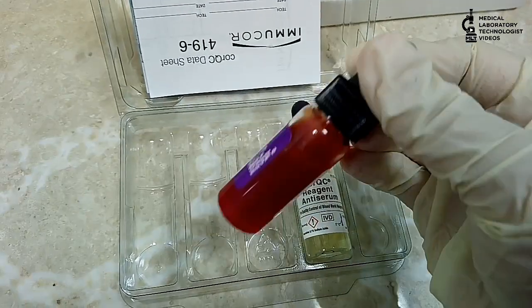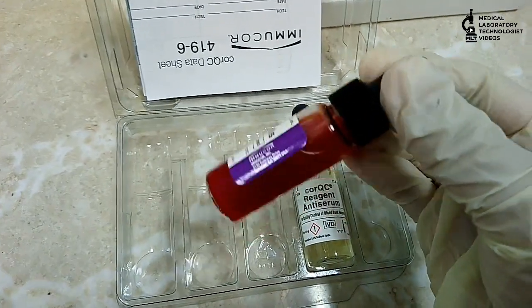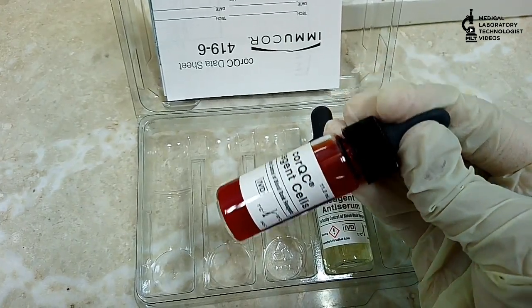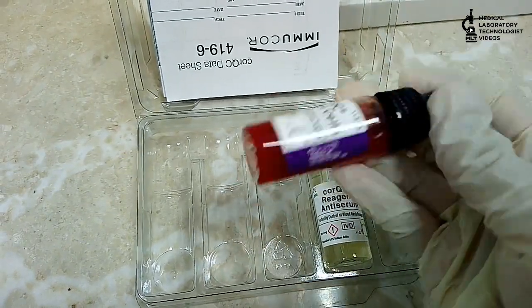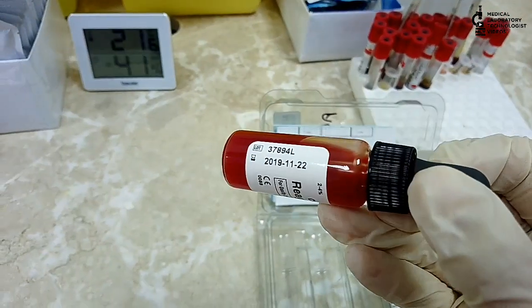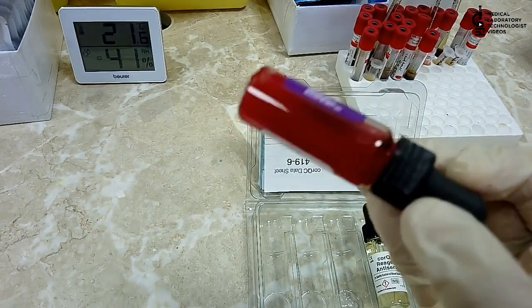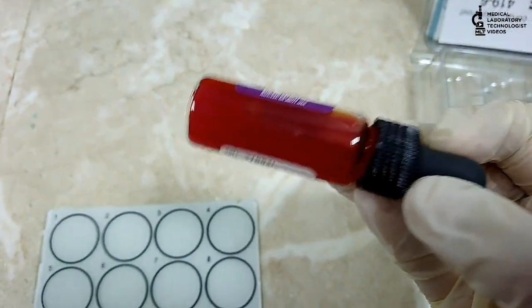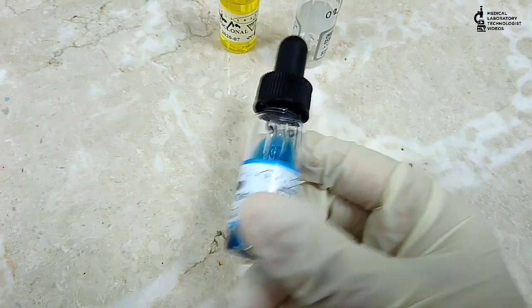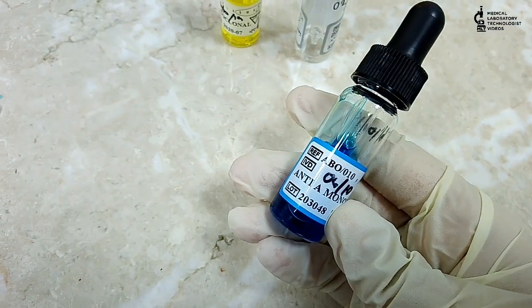These are cells, so you have to mix them properly. If you keep them in one position for a long time, the cells will settle to the bottom. So you have to mix well before using them.